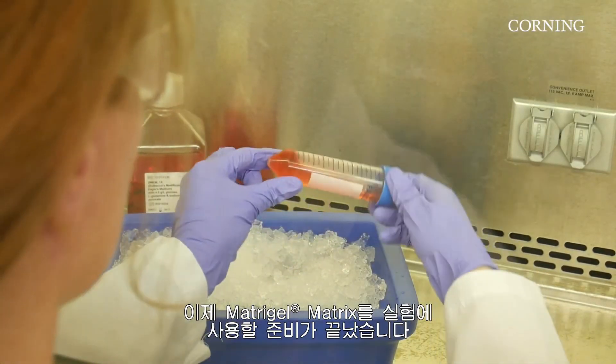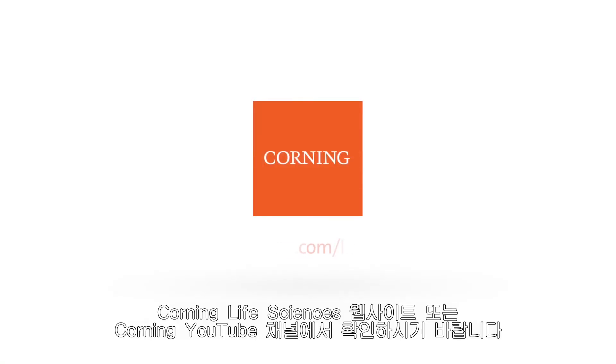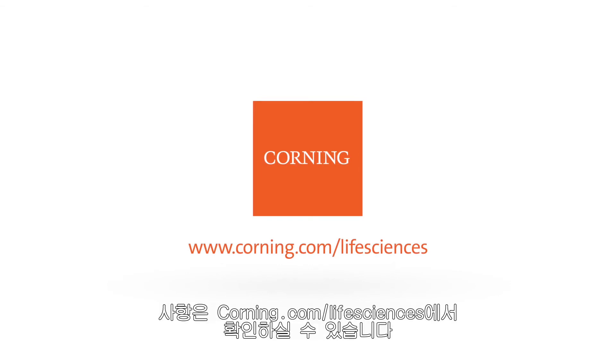Matrigel Matrix is now ready to be used in your research application. For more information on best practices, including coating techniques, please visit the Corning Life Sciences website or our YouTube channel. To learn more about Corning Matrigel Matrix and to see our comprehensive cell culture solutions, please visit corning.com/lifesciences.